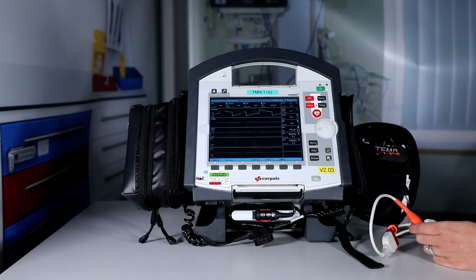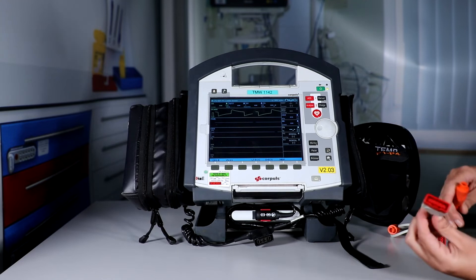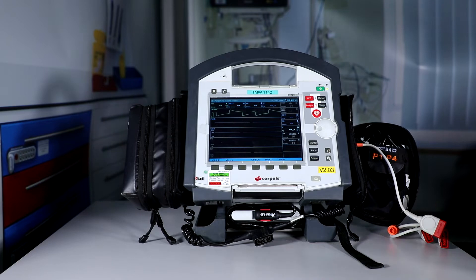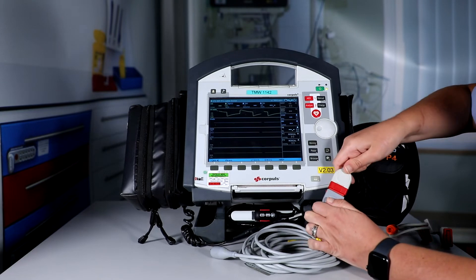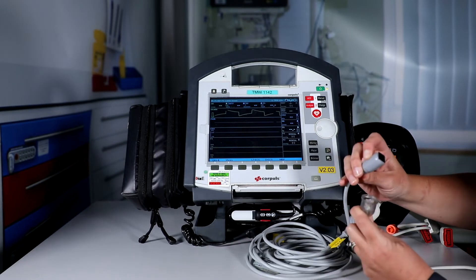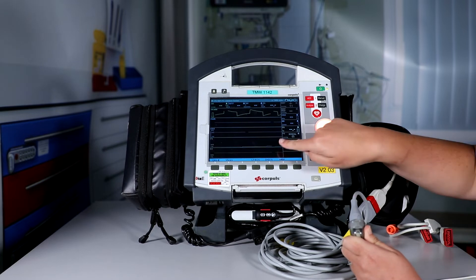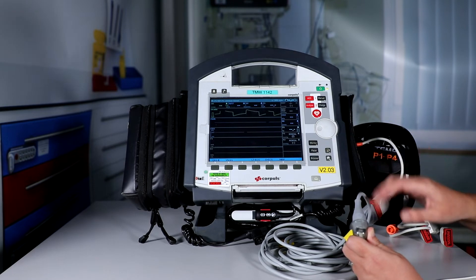Now we're going to check our invasive blood pressure connections for all three leads. For the single one first, we plug it into the P1 and P2 socket on the side here, then attach the pressure lead like so. This is where the dummy transducer comes into play — we connect it like this and what we're looking to see is where we had a dash line, that this goes into a solid line. As we can see, that has happened on the screen. We would then go in and check all our pressure leads with the same principle.